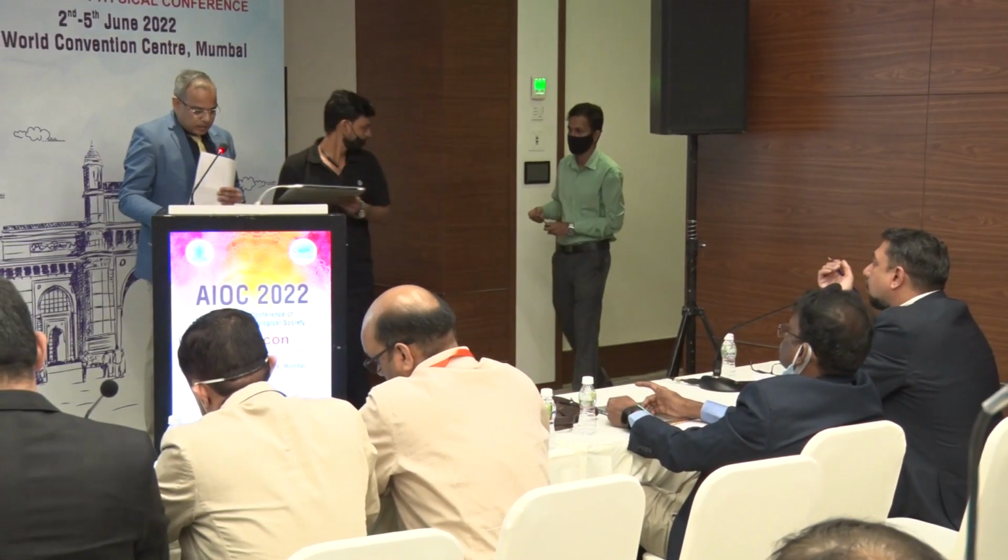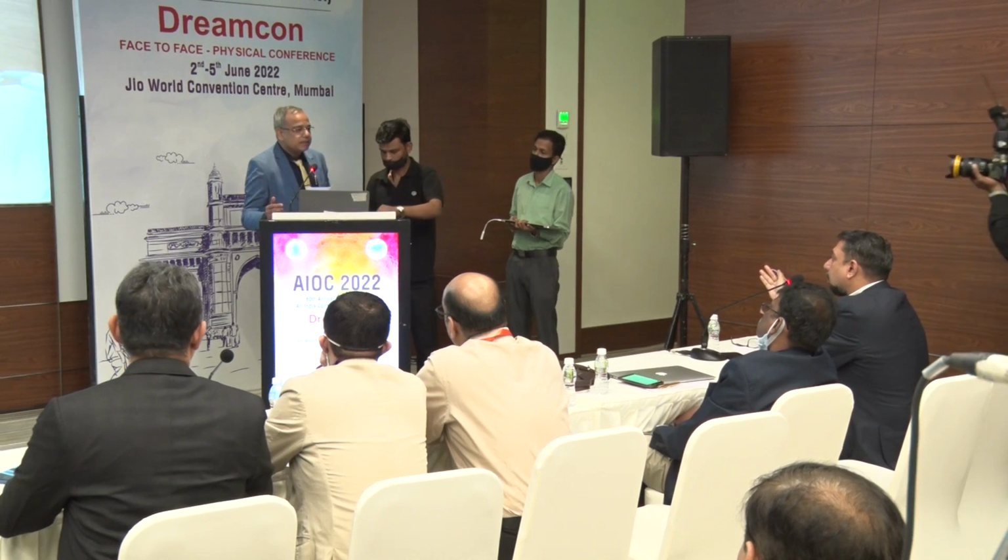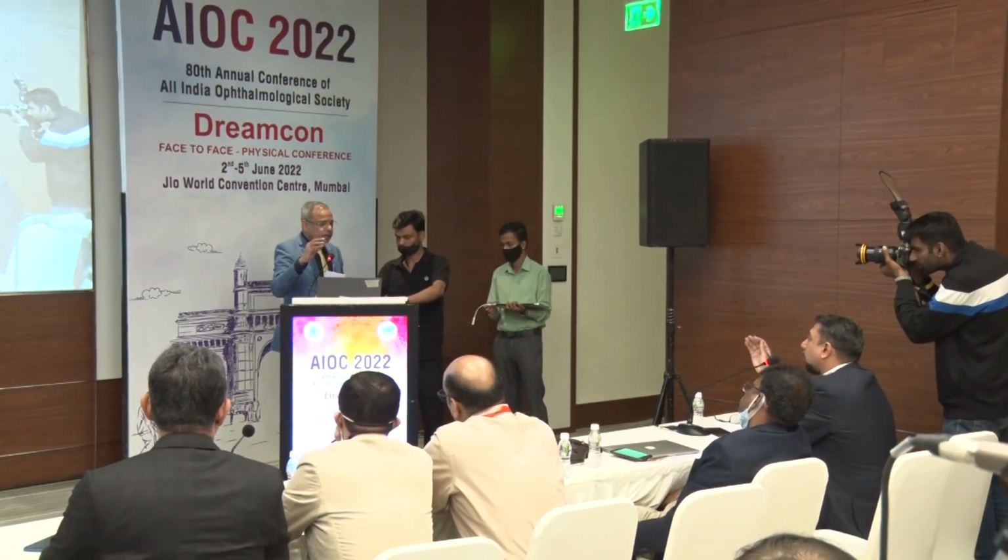One question: how do you maintain anonymization of data? That it comes, it is graded, and it is reunited with the patient data. How is it done on the instrument? Previously, we used the publicly available data. Right, and now we are using the data after taking the proper consent. No, but how do you separate the patient labels, grade it, and reunite it with the patient labels on the smartphone? If any image is fed, right? No, but you have patient data. You have to remove the patient data before it goes for grading. Yeah. And after grading, it has to be reunited with the patient data. How is that done? On cloud. So your patient data is not secure on cloud? Definitely, we are taking consent from the patient that it will be used. Okay, yeah, that's fine.